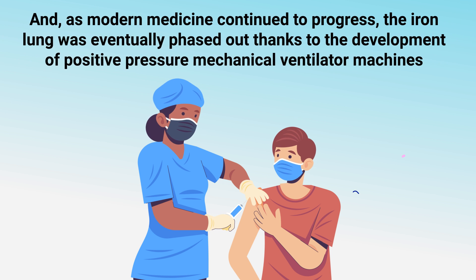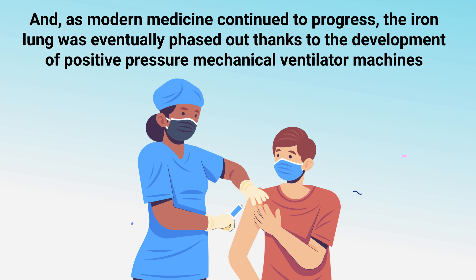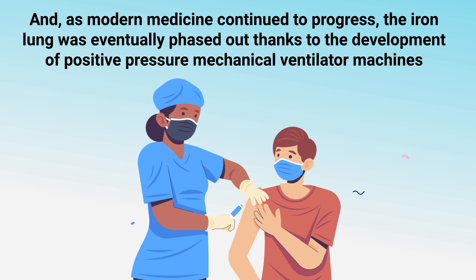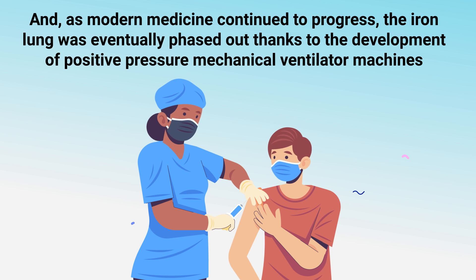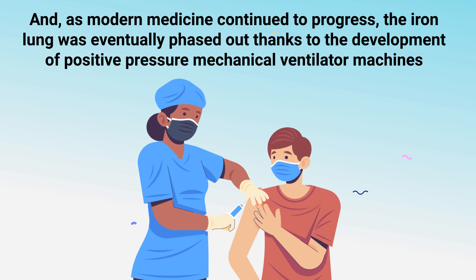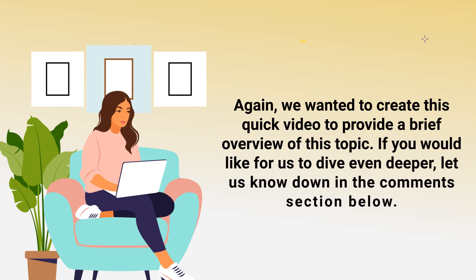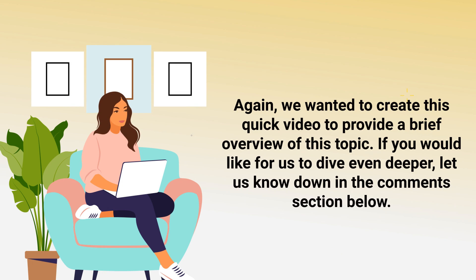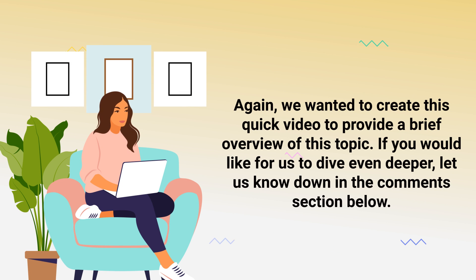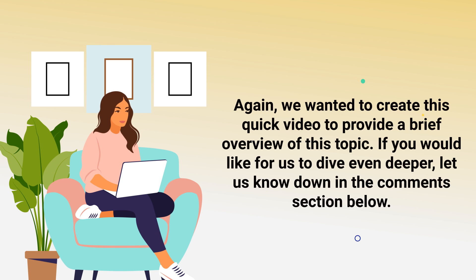Thankfully, polio vaccinations were created which eradicated the spread of poliomyelitis, and as modern medicine continued to progress, the iron lung was eventually phased out thanks to the development of positive pressure mechanical ventilator machines.